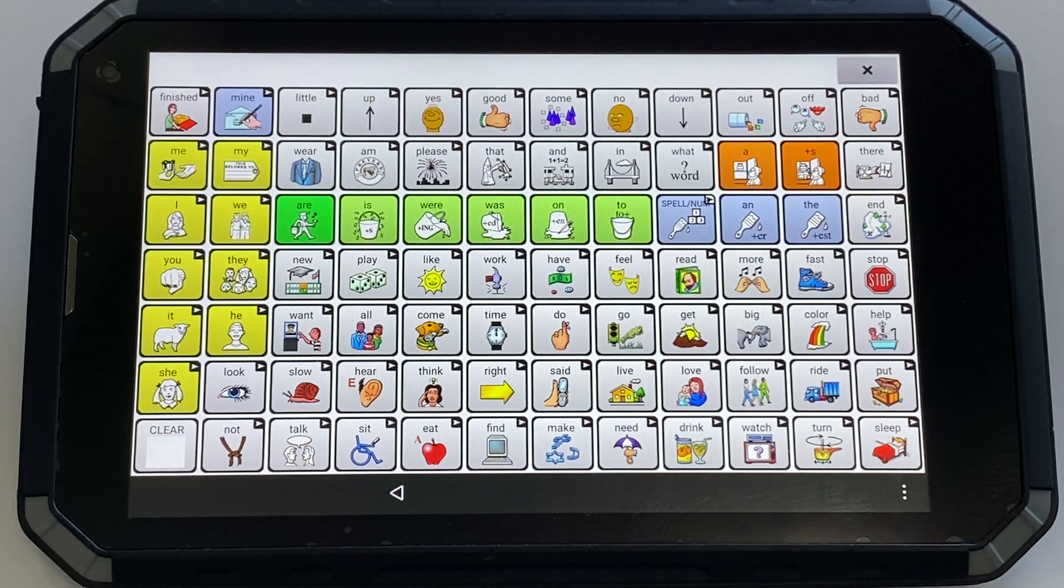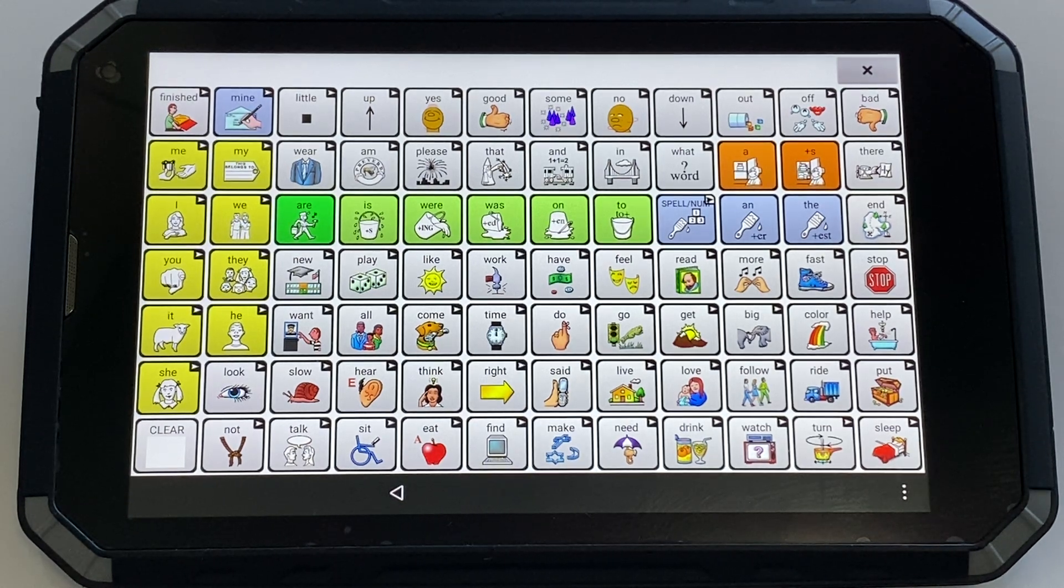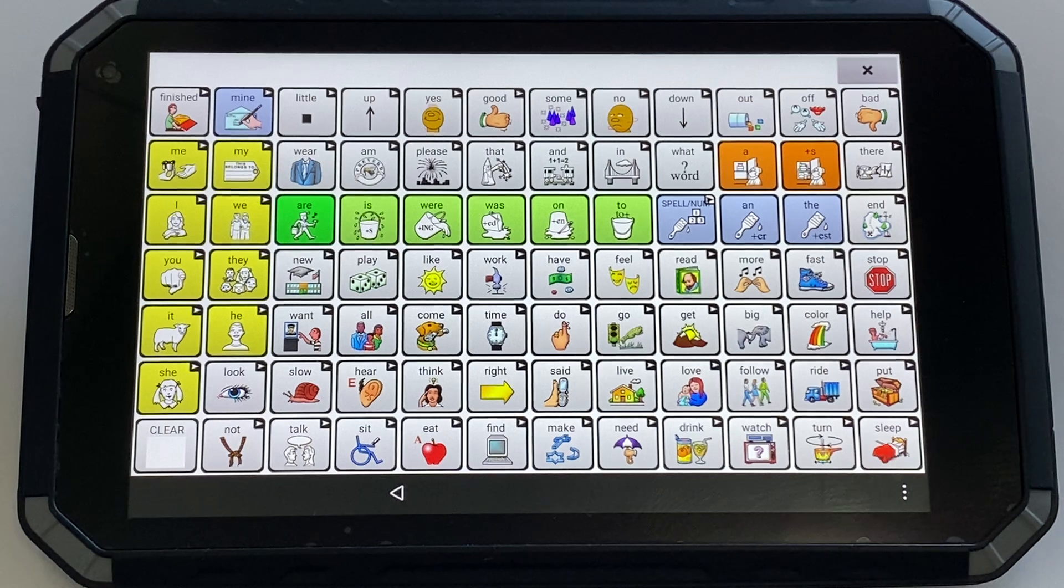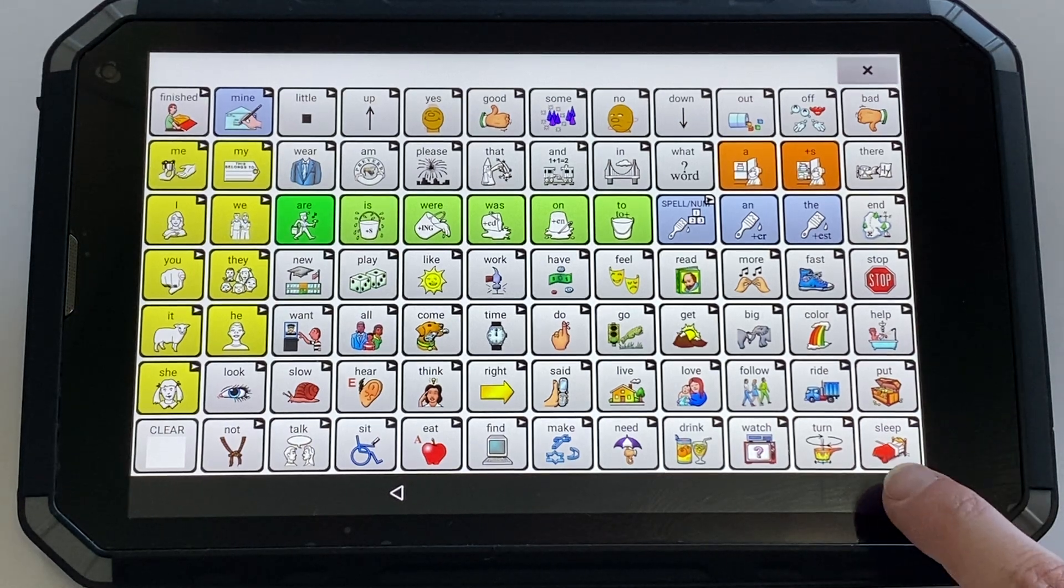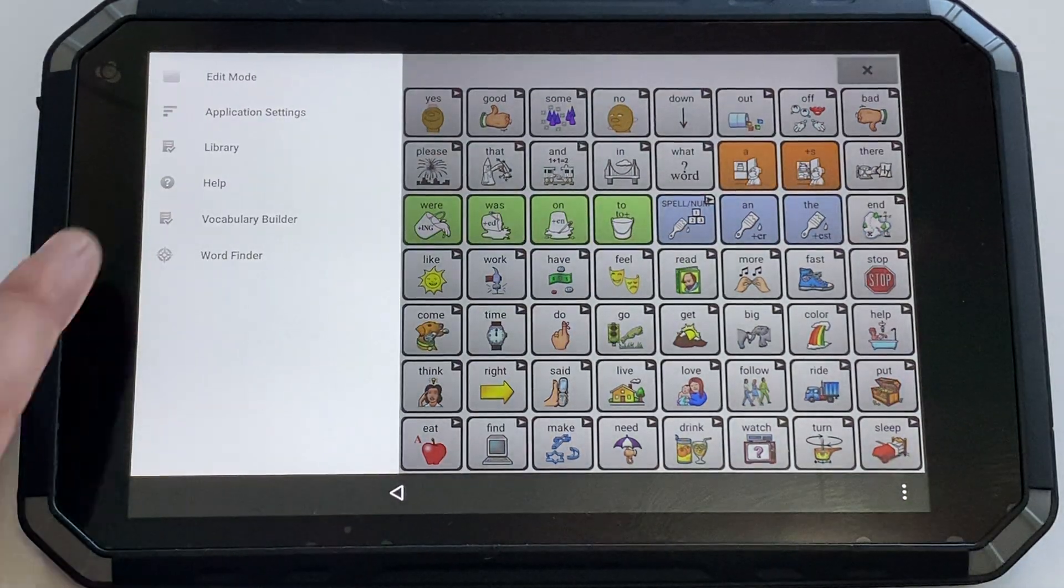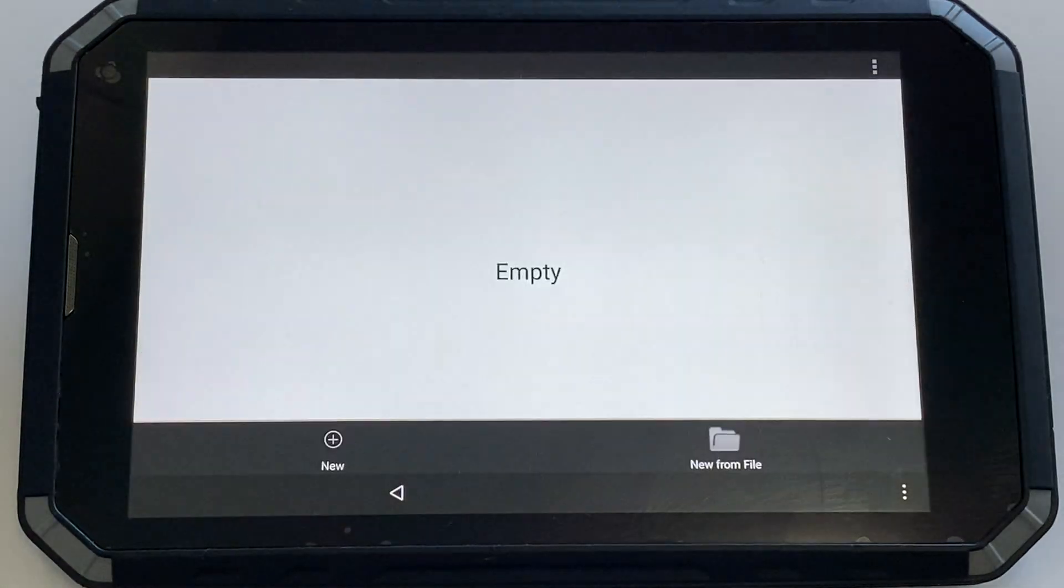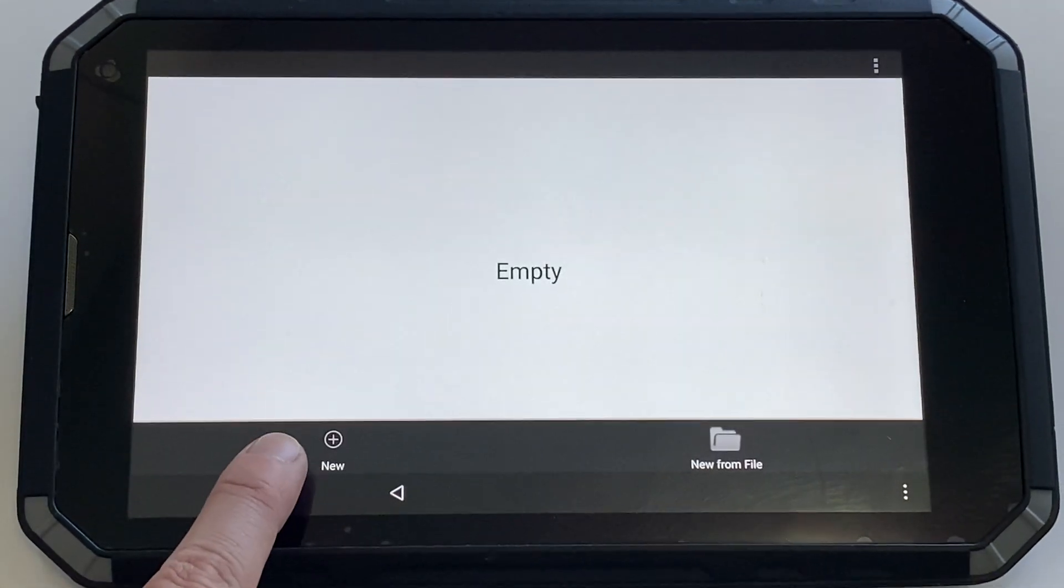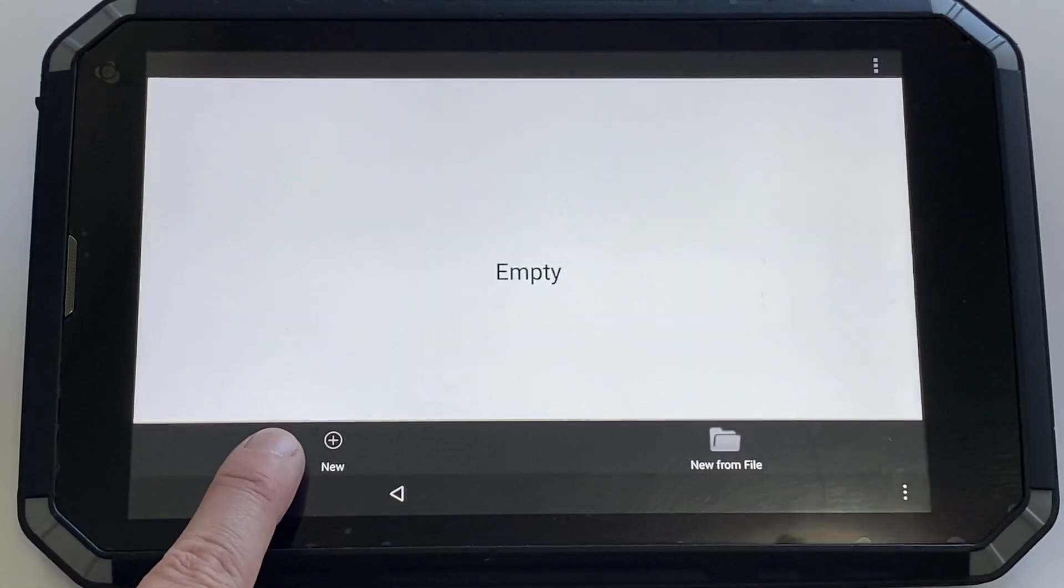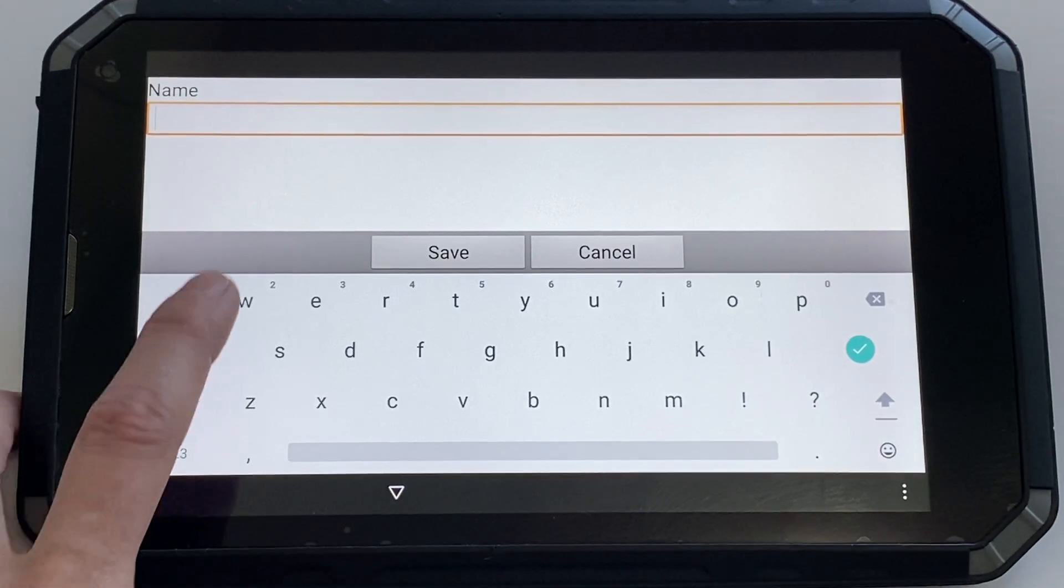First, you need a list of words that you're wanting to target. Then we can build the list. Choose the three dots and then Vocabulary Builder. To start a new list, click here. Then you need to give this list a name.